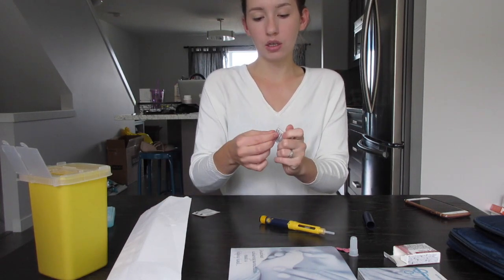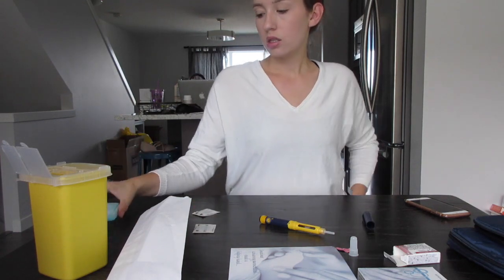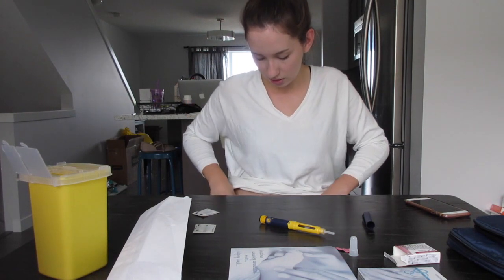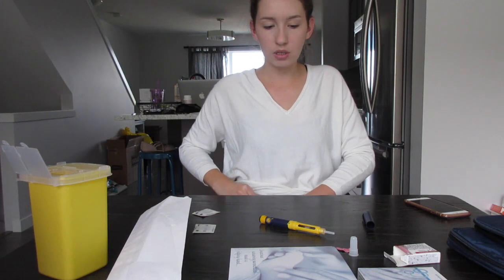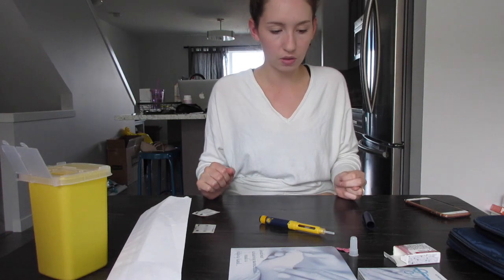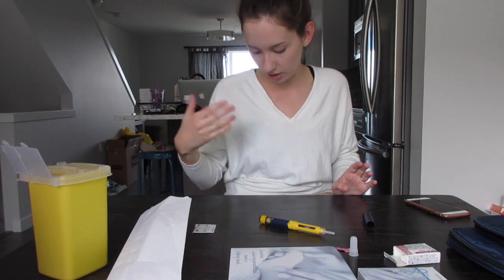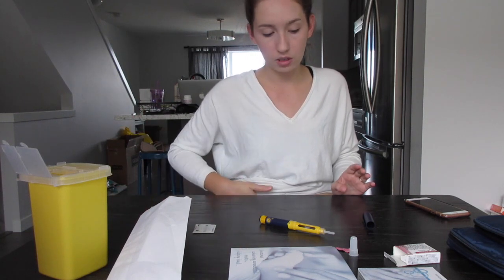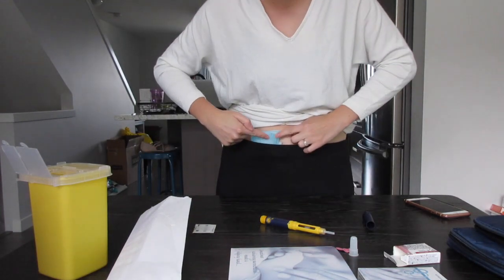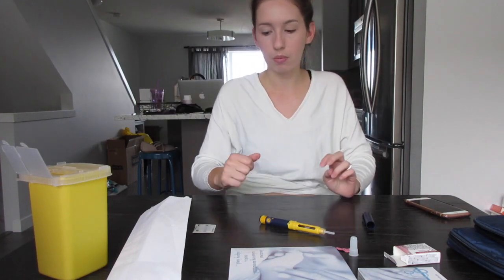So next you're going to need to clean the surface of your skin. So I'm just using an ice pack for about 30 seconds just to chill the area. I don't want it to be totally numb just in case that affects the needle's transfer. My nurse said it doesn't, but you know, I'm just gonna numb it just a little and then get started. So what I like to do is wear stretchy pants and I'll just put the ice pack in my band and just let it sit there while I'm preparing things.